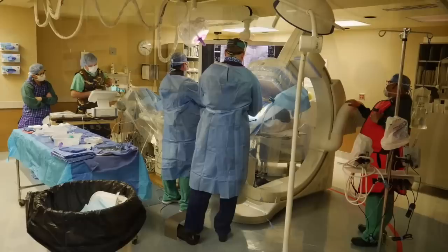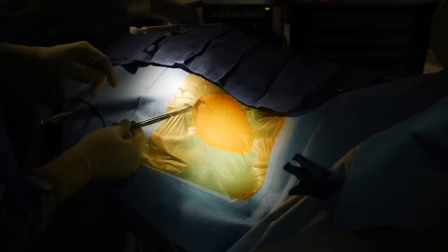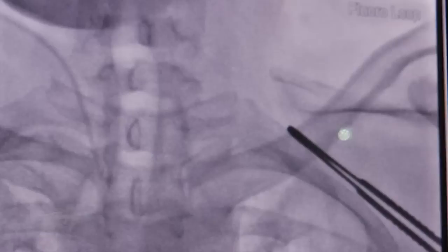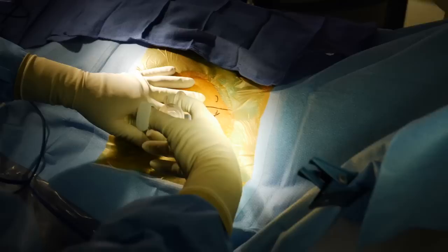We approach our table. The first thing we'll do is a venogram — we're going to image the vein through which we're going to implant the pacing leads. There is the vein, the large vein flowing down into the heart, and we'll use its location and the edge of the ribs to plan our incision so the pacemaker sits over the edge of the ribs. We identify it under x-ray and use black markers to show exactly where our skin incision should be.